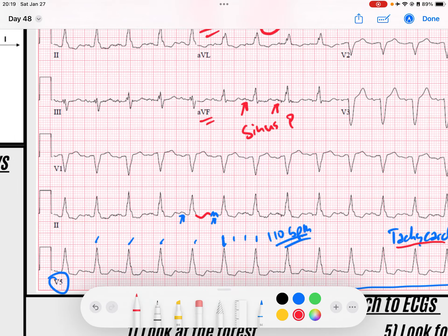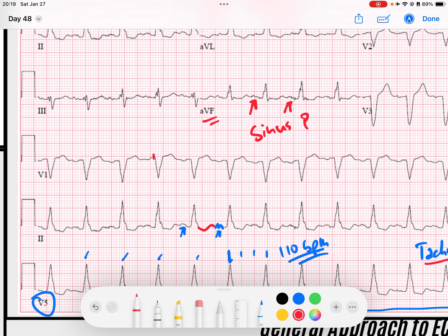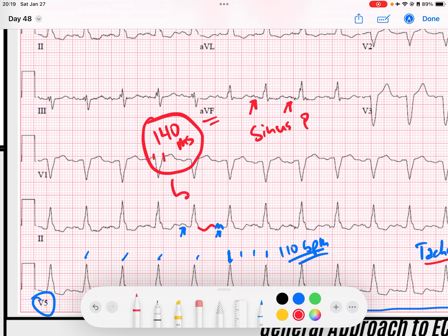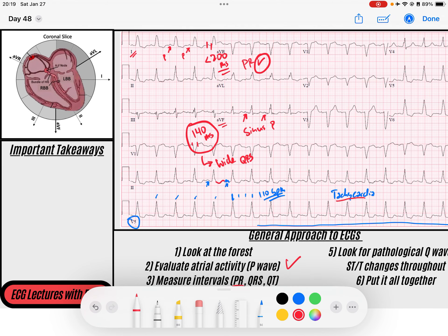The QRS we said is wide — let's measure that. It looks like maybe three and a half small boxes, so that would be a 140-millisecond QRS duration, which is a wide QRS. Let's look at our QRS axis: it's upright in lead I and upright in AVF, so that means it's going down and to the left — a normal QRS axis.